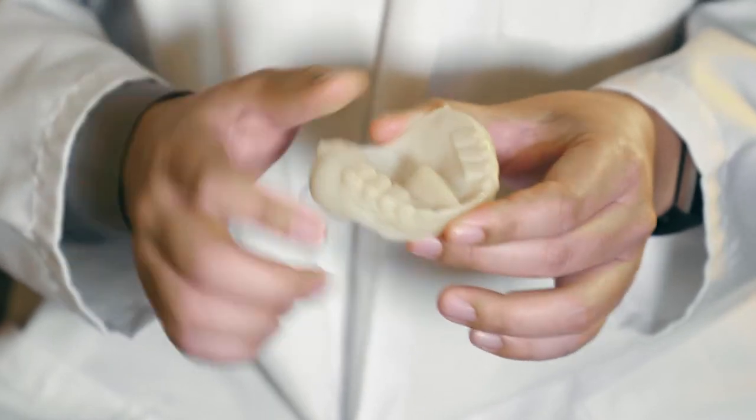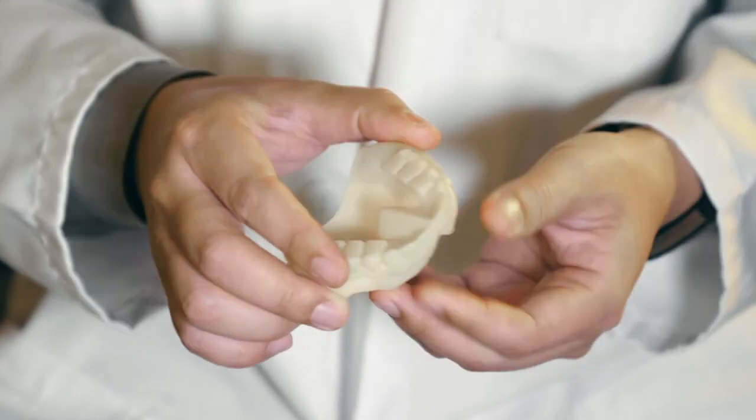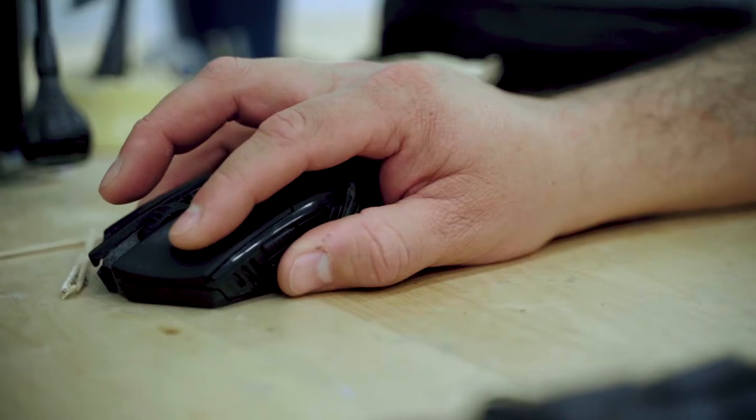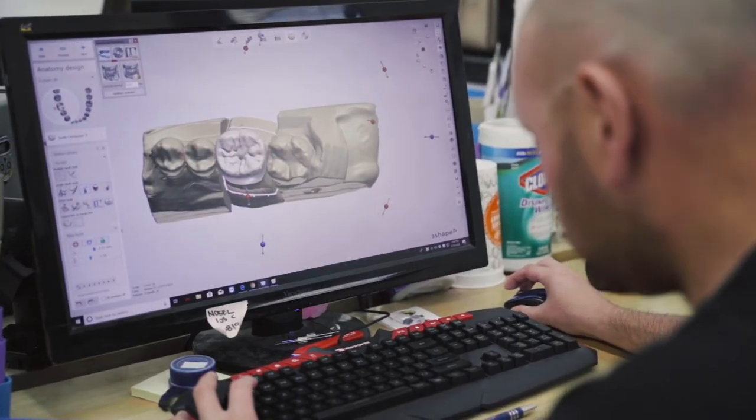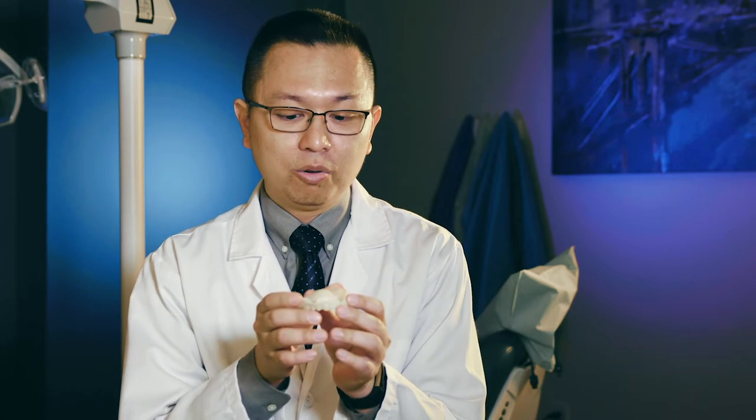This is an example of something that we had 3D printed. What we do is we'll take an impression of a patient's mouth, we will scan it in-house with our 3D scanner, and then we will design it on our computer program. In this process, we're able to figure out where the teeth need to be, the size of the teeth, and also the margins of the impression tray itself.